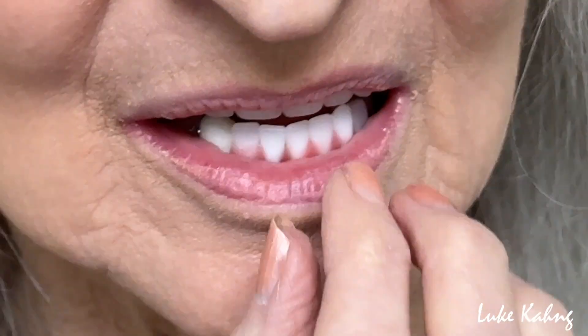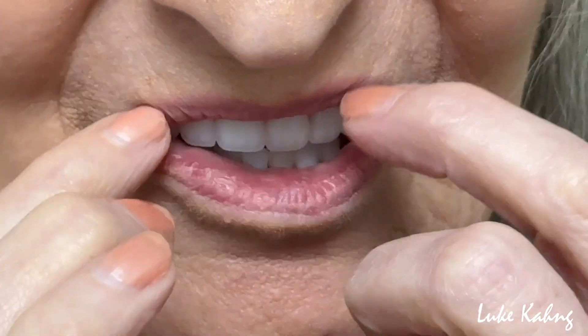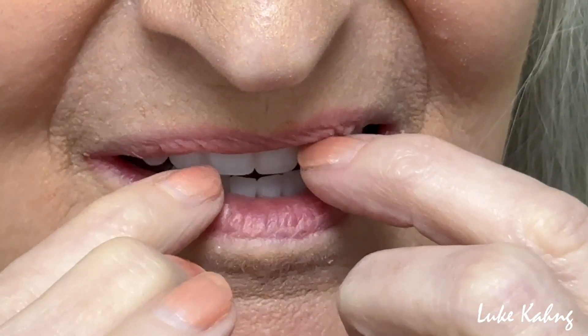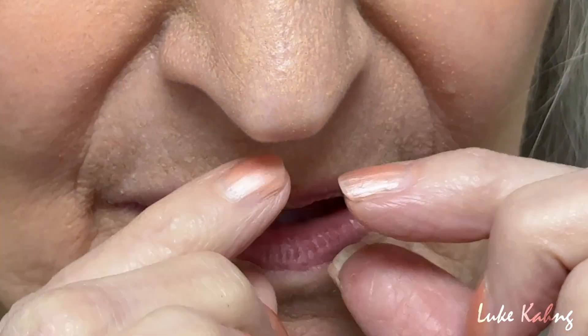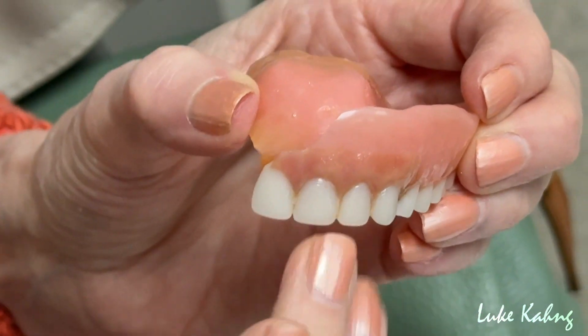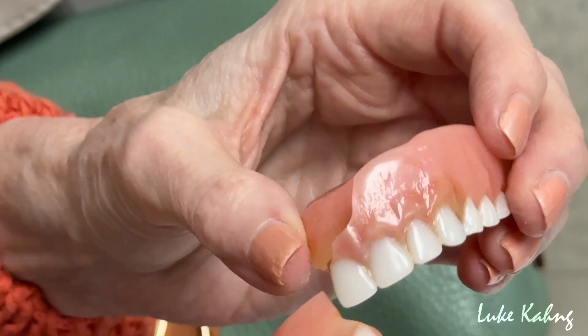So tell me about it. We can fix it. I just want these teeth not as long — so if the gums could be showing more. Gums showing more? Make the teeth look a little more square than long — they're just too long for me. And also my regular ones — my old ones were tilted out a little bit more. If that could just tilt out a little bit more. Flutter out? Flutter just a little bit. Okay.